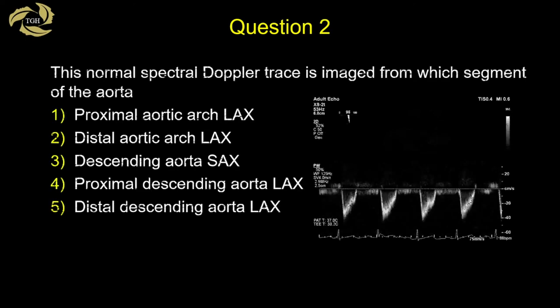Question two: this normal spectral Doppler trace was imaged from which segment of the aorta? A pulsed-wave sample volume was positioned in a particular part of the aorta, giving a very normal trace. This requires some cerebral effort to tease out, but you should be able to arrive at an answer.